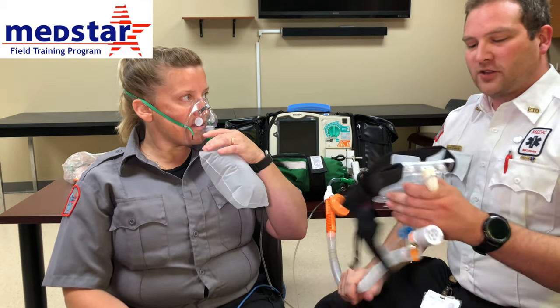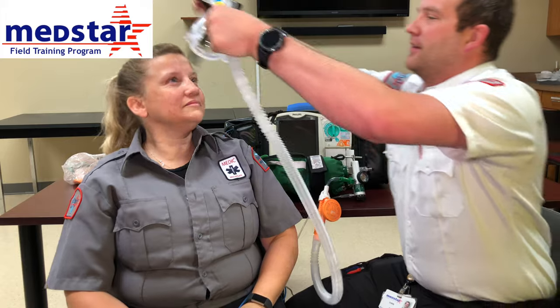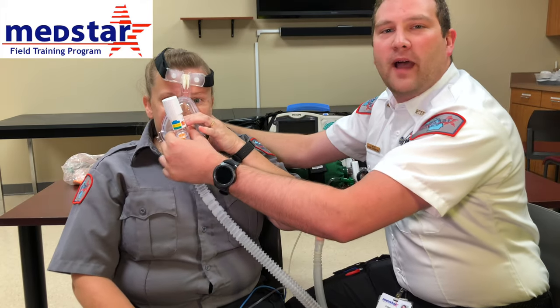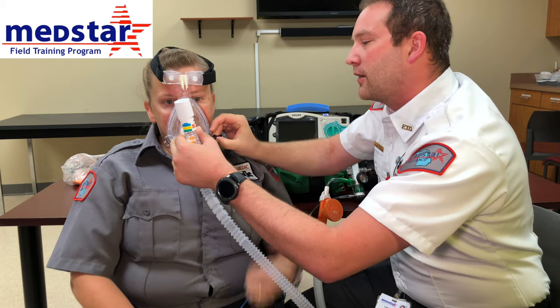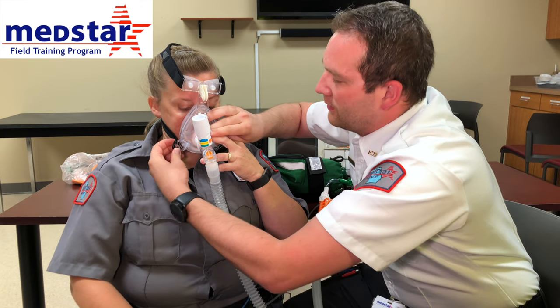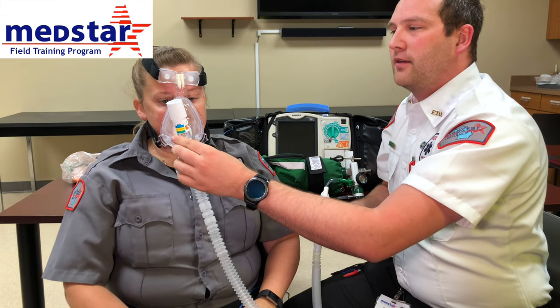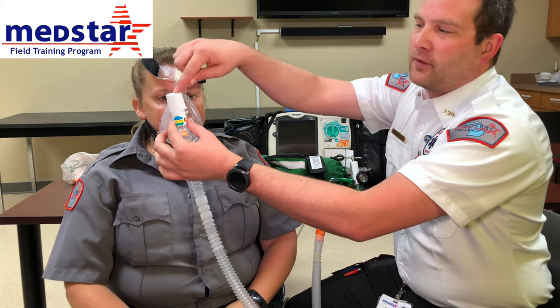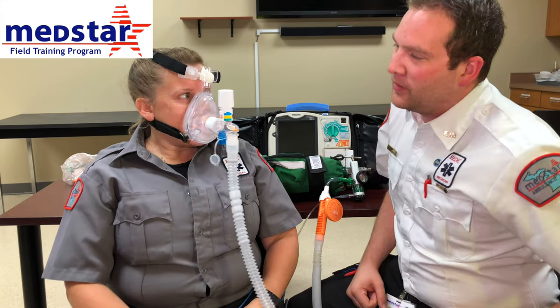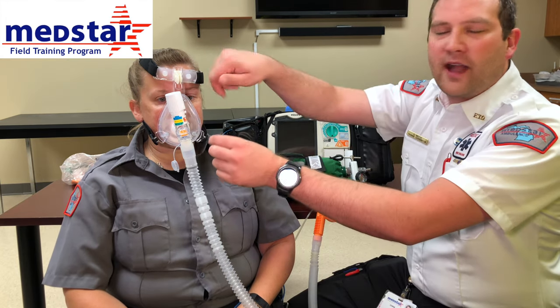Walk your patient through what you're about to do: you're going to take the current mask off and put a new mask on. Place it on their face — the strap goes behind their head, comes around to the front, and clips in. You should hear them snap in. There are Velcro adjustments on the sides. Instruct the patient to take a nice easy breath in and out, and let them know it's going to start helping in a couple of minutes. If needed, there is a PEEP valve adjustment with three settings: 5, 7.5, and 10. For severe patients, normally start between 7.5 and 10 — just dial it down.